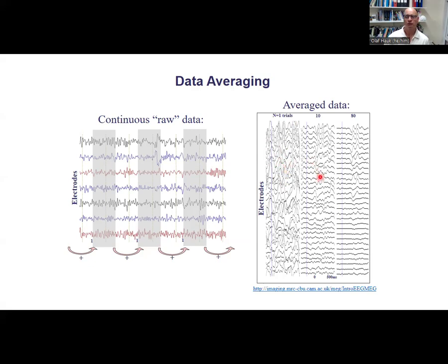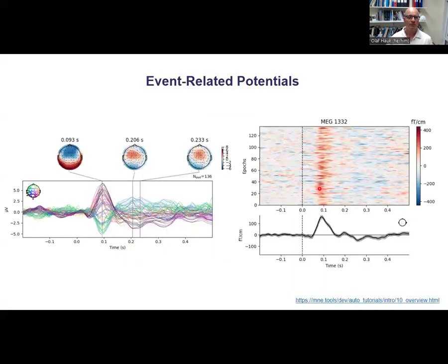That's basically just one little piece of ongoing brain activity cut out. If you average 10 trials together, in this case, and I think that was a visually evoked response, you see something like an evoked response emerging here. It's slightly higher than here in the baseline period. Obviously, before stimulus presentation, we shouldn't really see much, at least nothing that's specific to the stimulus. And after 80 averages, we are in business. So we have a relatively small baseline and an evoked response in multiple channels here. So that's what we want. So ultimately, we want something like that.